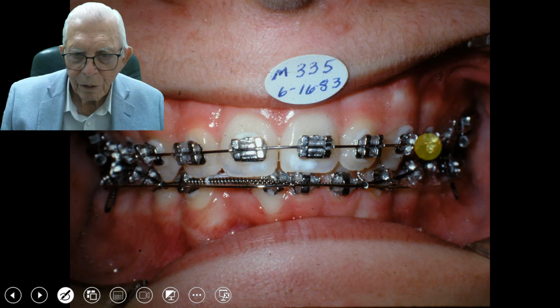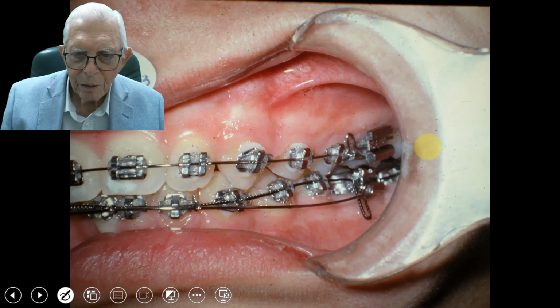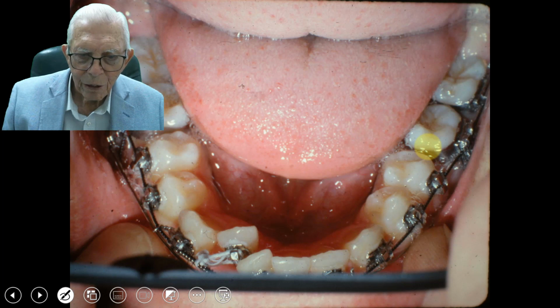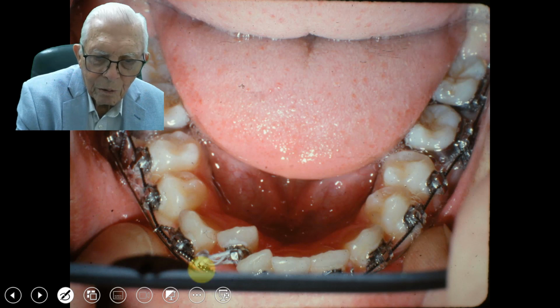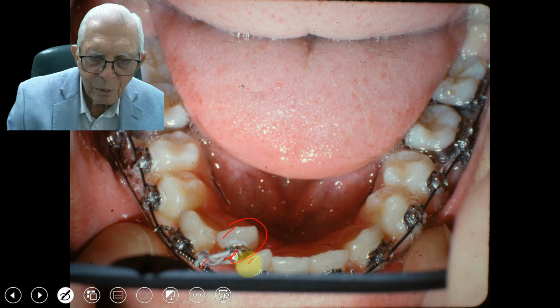Now we're then bringing this down a little further, and we've still got a spring in that area. And we've got our double wire going in. And I'll show them on the bottom. Now we've got it around to this point, and what we could have done in here is hook this and here, wrap it around like that, and hook it on this deal to turn this around in this direction.